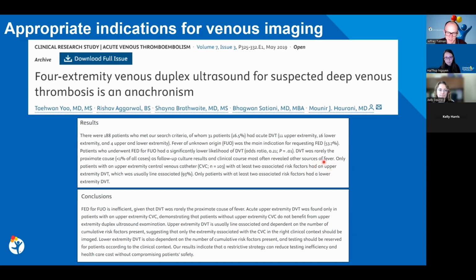Yeah, definitely work to be done on this. I'll let you know how it goes. I also wonder if some of this is coming from, and not to knock my adult vascular surgeon colleagues, a lot of the requests we get that don't quite make sense are because a vascular surgeon on the adult side has recommended it. They have to remember that it's not a vascular lab we're running, it's imaging Doppler. Sure. So if that's where some of these orders are coming from, I would also recommend reaching out to the adult vascular side. Yeah, that's a good point.